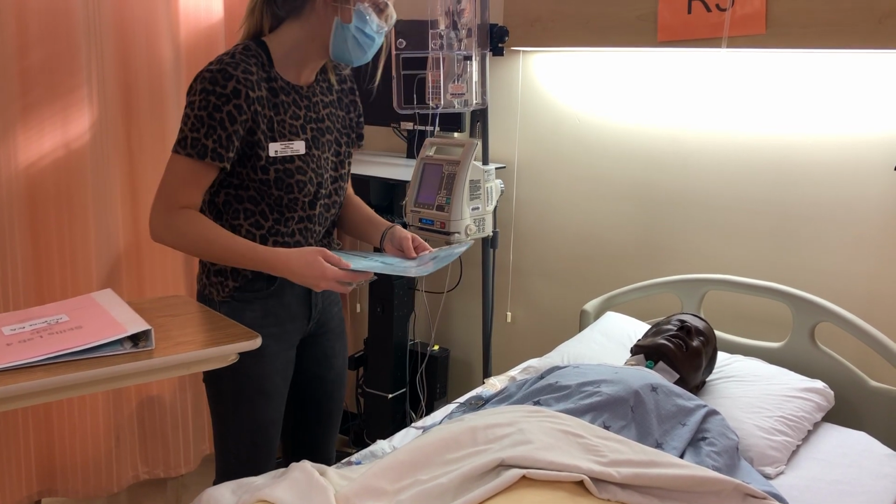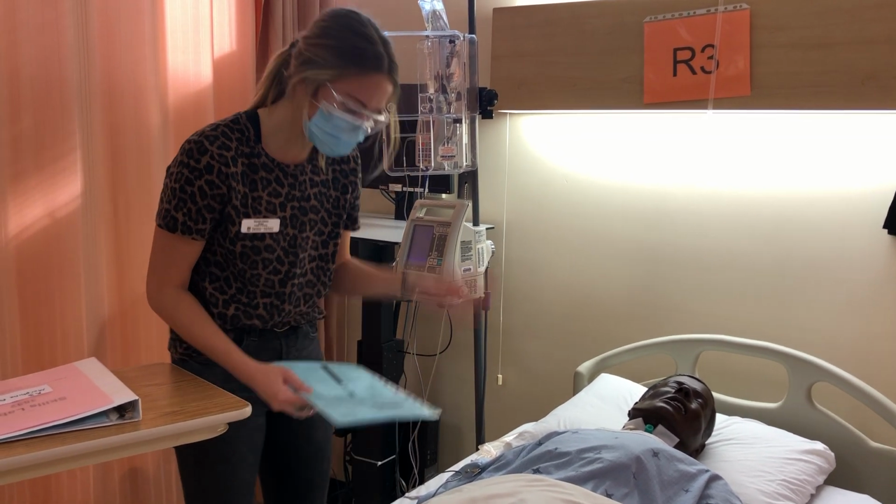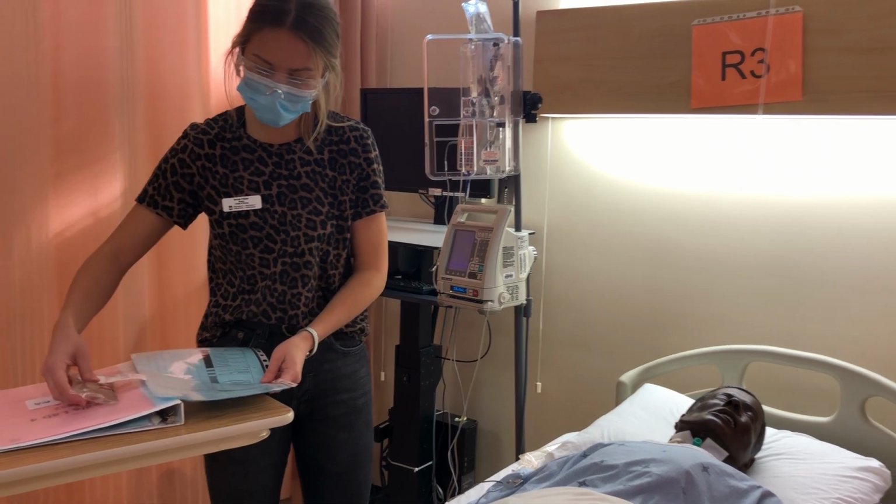And can you state your first and last name for me? And do you have any allergies? Wonderful. What's your birth date? Great. So he has no known allergies, and that's all been verified. So I have the right patient.